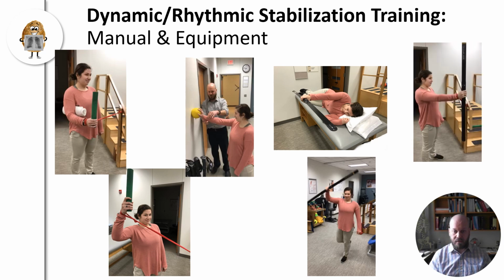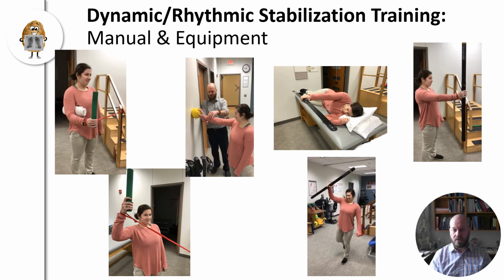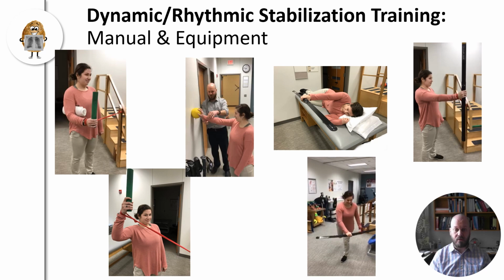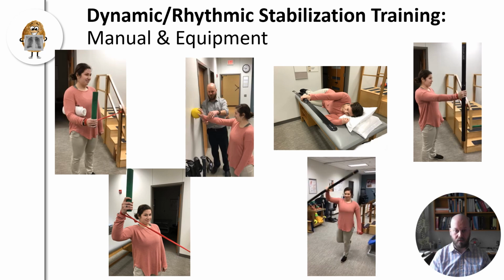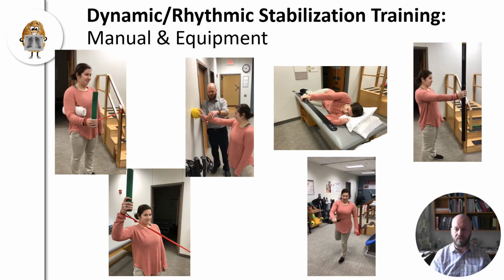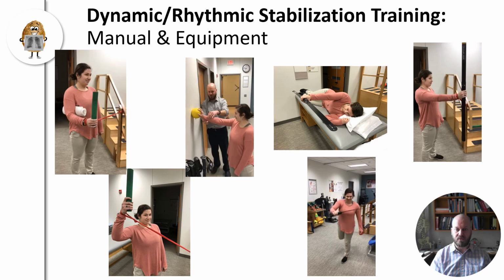And finally, this is having the patient in a single leg stance going through a diagonal D2 PNF pattern, which would simulate the throwing or hitting or tennis serve motion, for example. So moving into some sport-specific movements with these rhythmic stabilization techniques using the body blade.